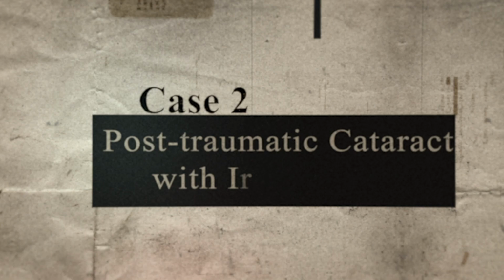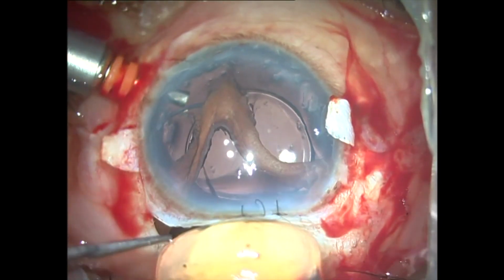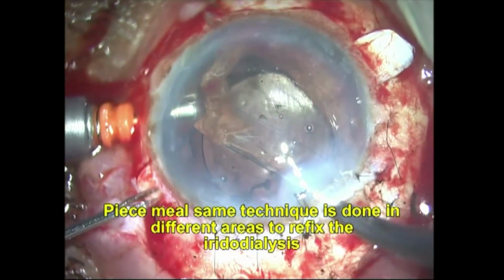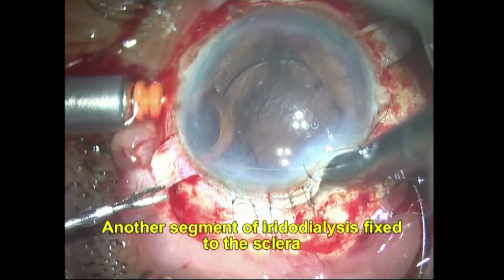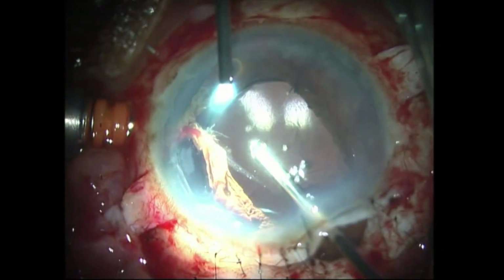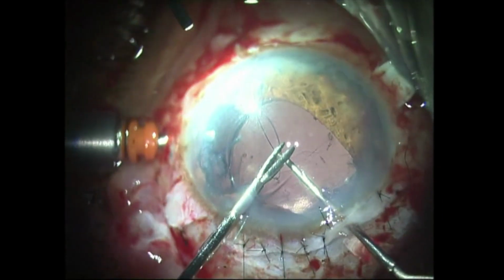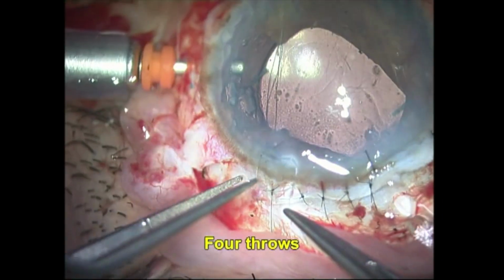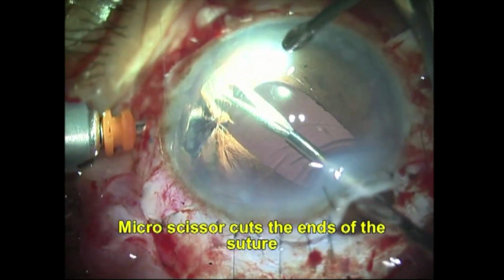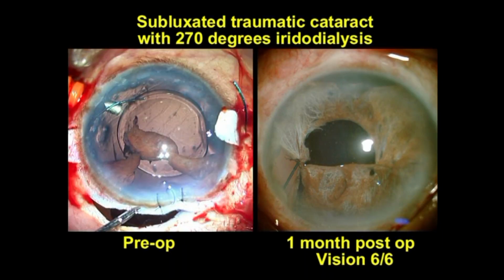The next scenario is that of a post-traumatic cataract with iridodialysis. The ENDOILLUMINATOR helps us in visualization of the remnant iris while we use the piecemeal technique in different areas to refix the iridodialysis. It also aids in better visualization of the vitreous strands when dye is not used. Furthermore, it helps while passing the 9-0 needle through the iris during single-pass 4-throw pupilloplasty and cutting of sutures post-SFT.